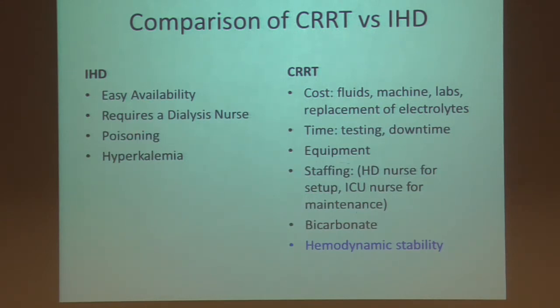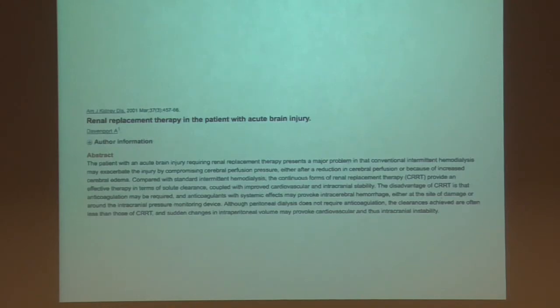But for poisonings and severe hyperkalemia, you have to do regular dialysis because of the blood flows, you get better clearance. So if you get intoxication, you don't just do CRRT. If you want, you can do the initial amount of hemodialysis and then flip over to CRRT to do it overnight. But that's just, I'm going to leave that.